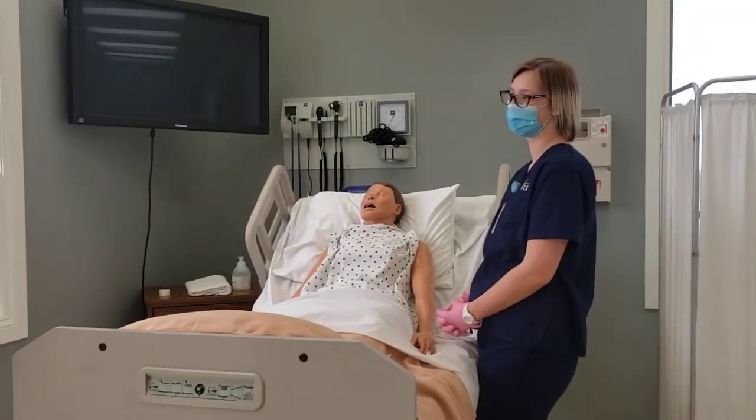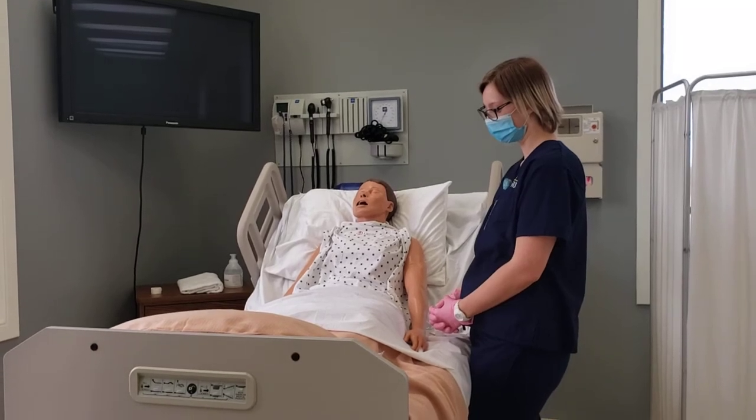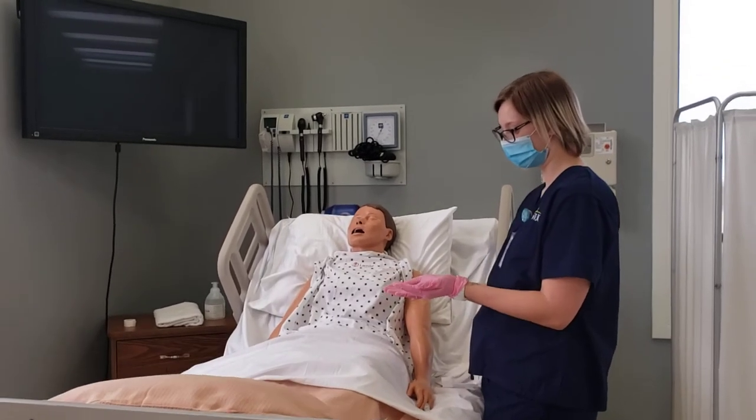Leanna is going to be our demonstrator. Leanna has already identified the patient with two identifiers. She has performed hand hygiene and donned her gloves.